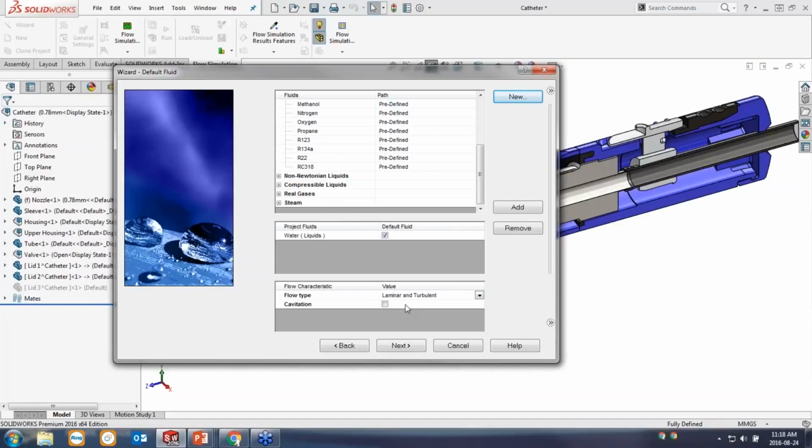There are some small options down here that I'll just briefly mention. This one here, laminar and turbulent. This is a great example of somewhere in flow simulation where the default option takes care of decisions for you. These settings are places where flow simulation really does separate itself from other CFD tools. A lot of them, those specialist level tools, require you to make decisions like, is this laminar flow or is this turbulent flow? And so you have to predetermine what the Reynolds number is, and you have to know which regime you're in.